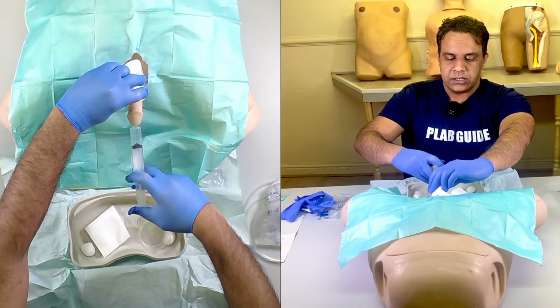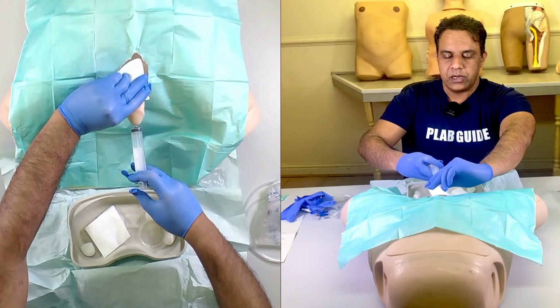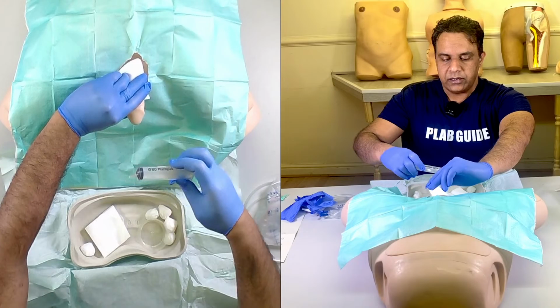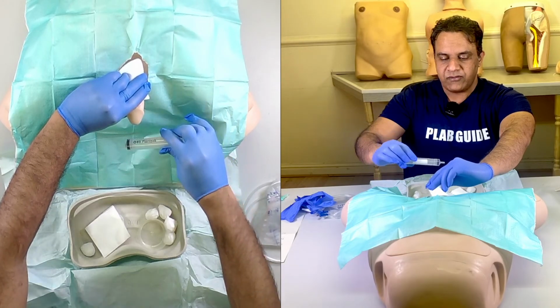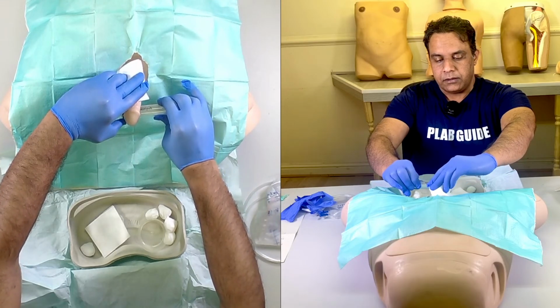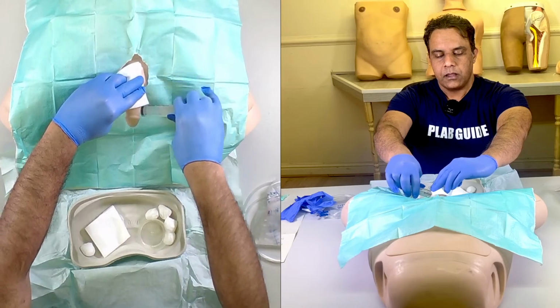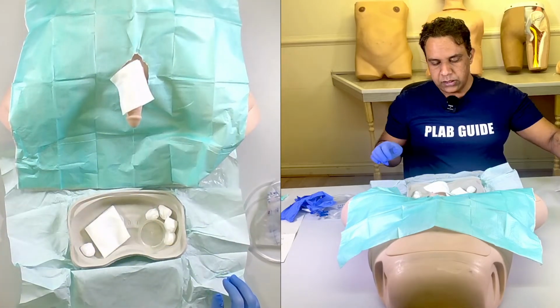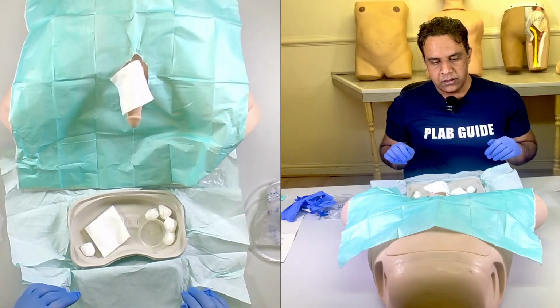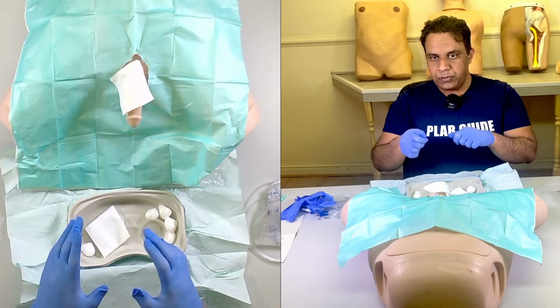Inject the instillagel and pinch it at the bottom so that the gel remains inside. You can use the shaft of the syringe to squeeze it in. And this goes in the clinical waste. Now this is a point when you have to remove the top layer of the gloves.